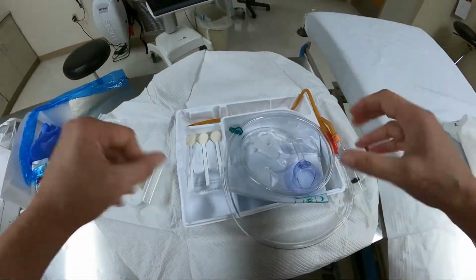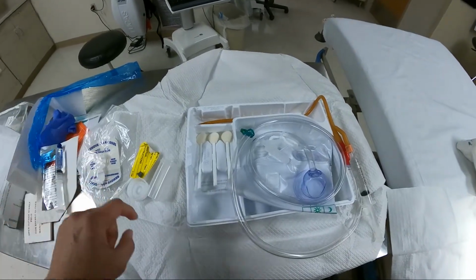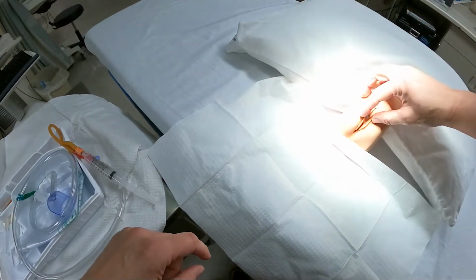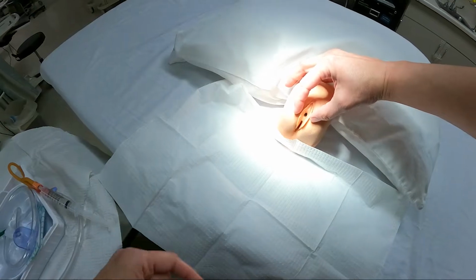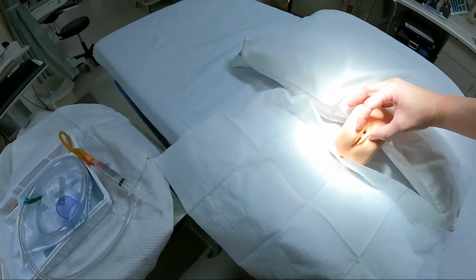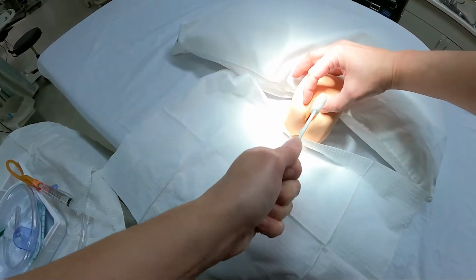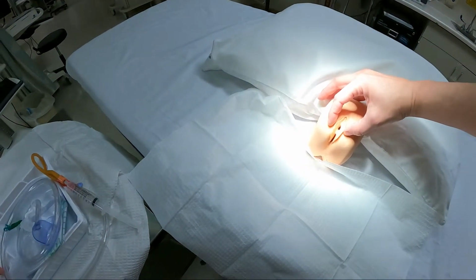Once that's all done, once you touch the patient, the hand that touches the patient stays where it is. So you're going to go ahead and put your, in this case, you know what we're doing. You take one swab and you swab, throw away. Second swab, swab, toss. Third one, toss.